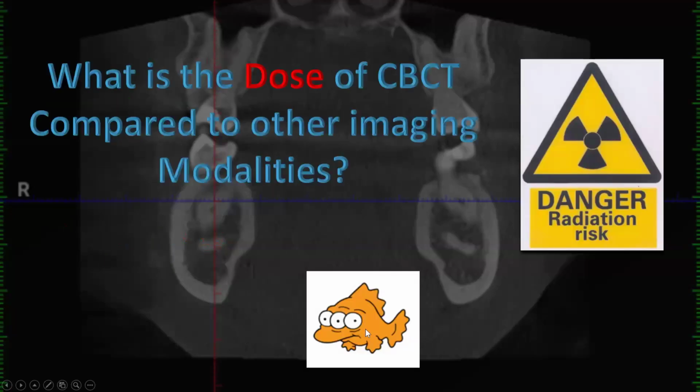All right, so what was the dose I told you to remember for cone beam CT? Just on average, because there's a huge range. What's that number? 100. Yeah, 100 microsieverts, just kind of an average dose.